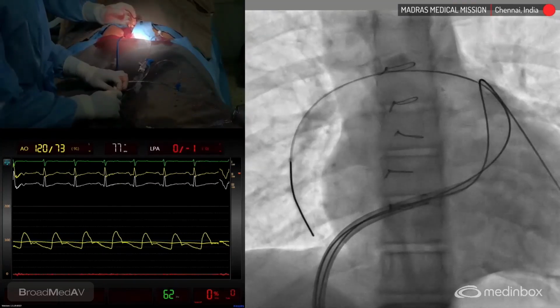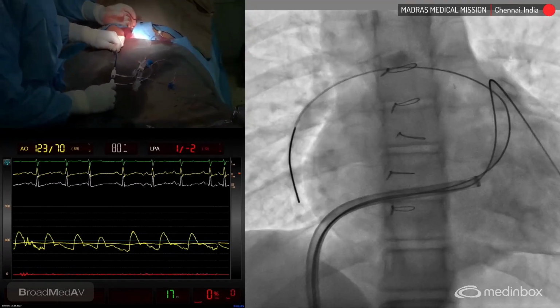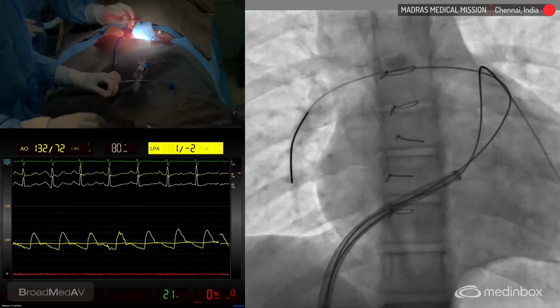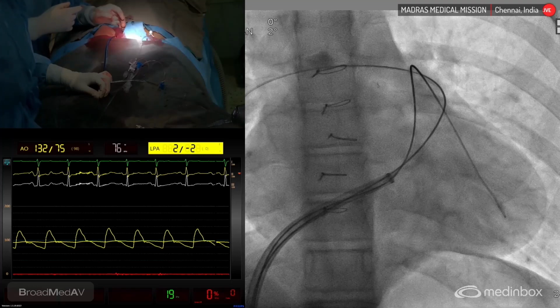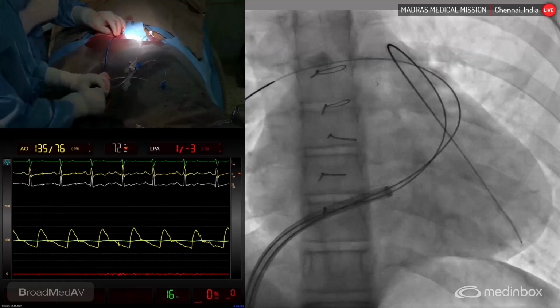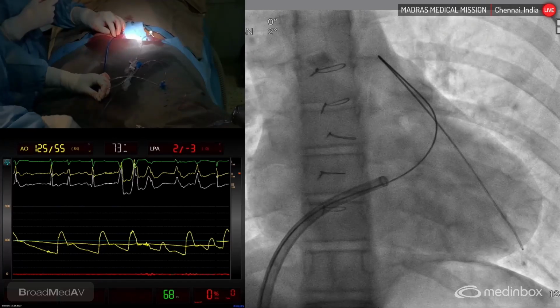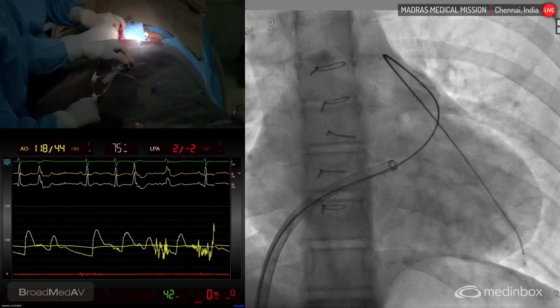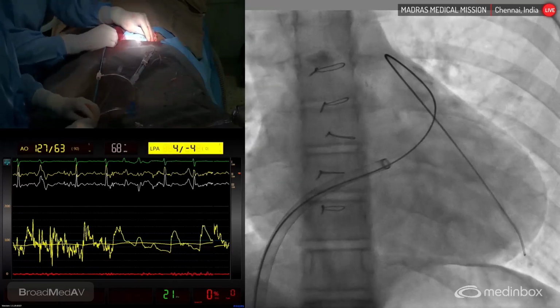The problem that we are facing currently is that the dilator is not able to manipulate its way. So what we'll do is we will now switch over, show the other guide wire position. Yeah, so I'll get the LPA wire deeper. I'll remove this Lunderquist wire now. I'm taking out the Lunderquist. I'm taking out this dilator, holding it, and I'm switching over to a single lumen dilator.